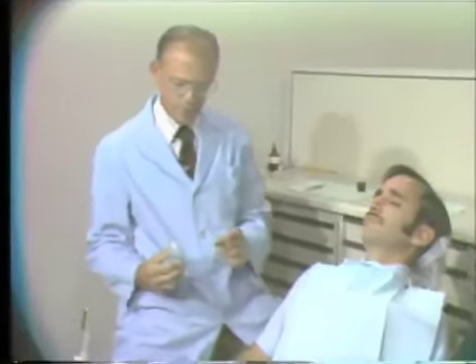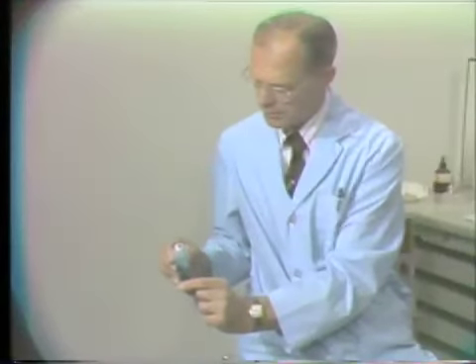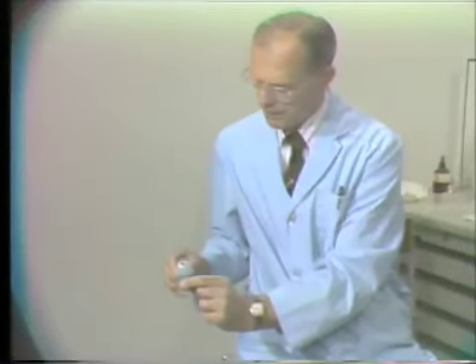So that we don't spray our patient, we move aside and flood the surface of the slide with the fixative material. When the slide has dried, it is then ready for shipment to the pathology laboratory for examination. This concludes the portion on exfoliative cytology.